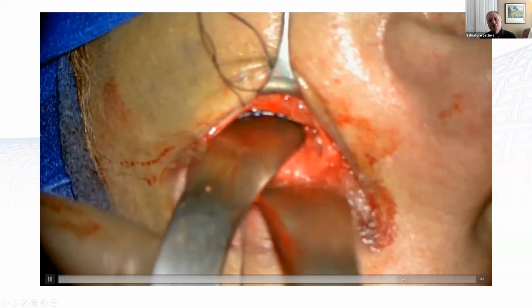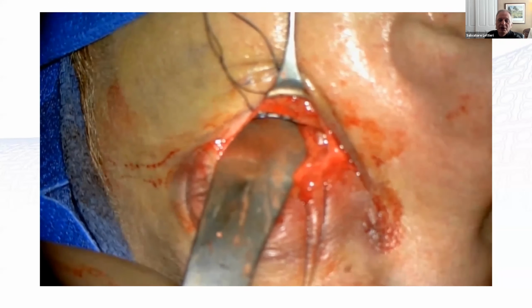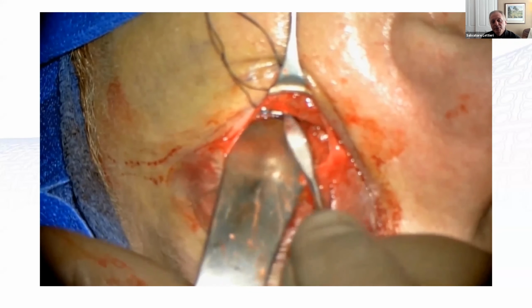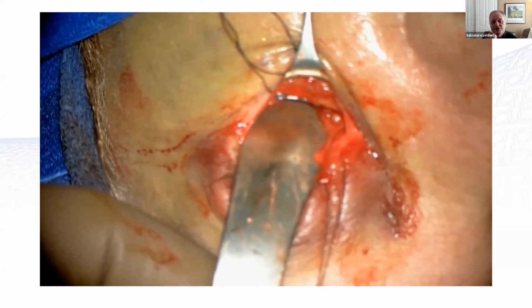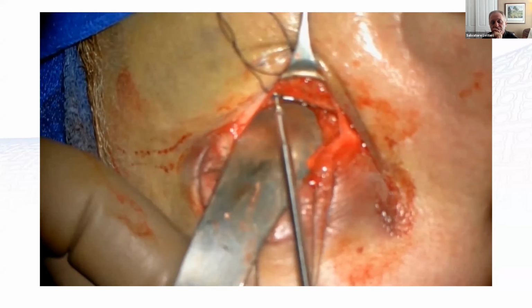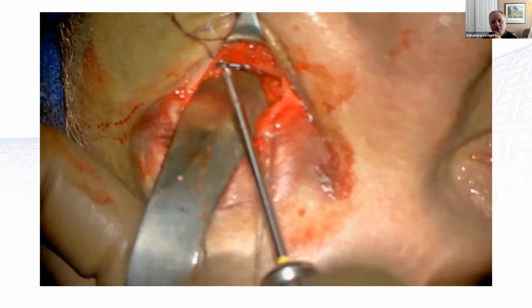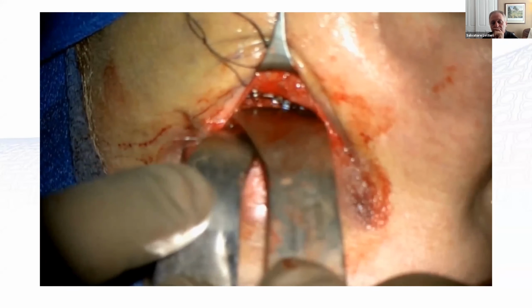And then once you do the screws, there's always a discussion about repairing the conjunctiva. I repair it because what we've done is we've disrupted the entire floor. It just takes about 3 or 4 sutures. I use a 7/0 polyglactin suture to place into the conjunctiva, because sometimes what happens is you have fat that'll herniate out and it'll granulate over. So I go ahead and repair it.